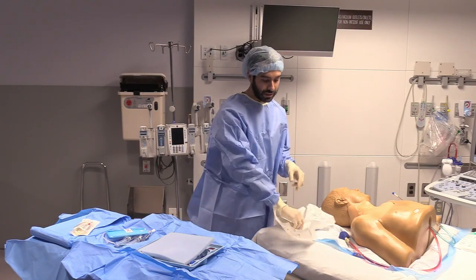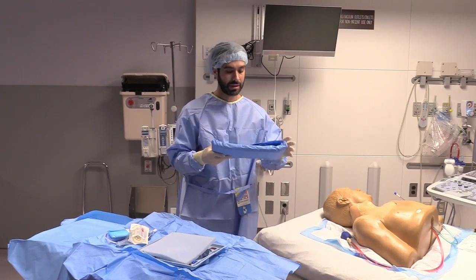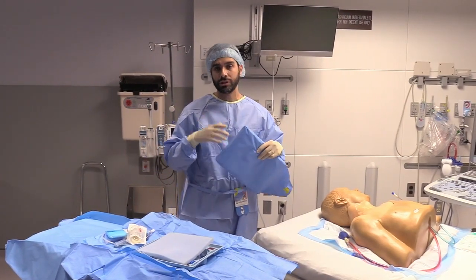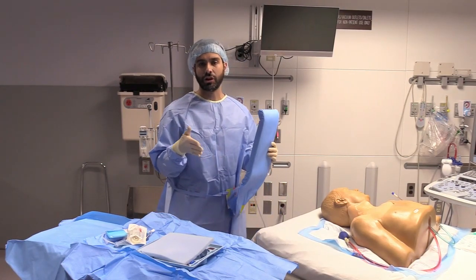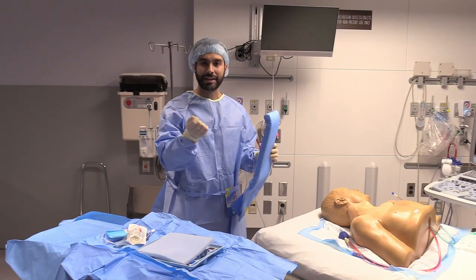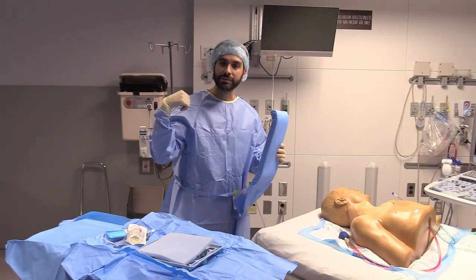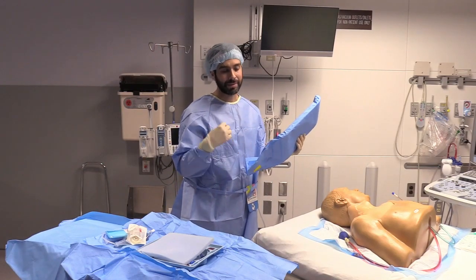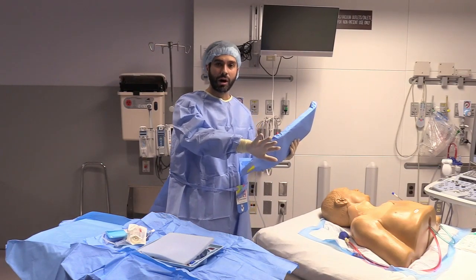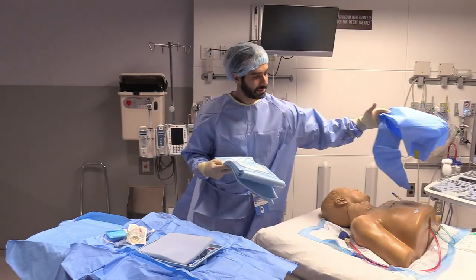So once you've got your gloves on, then you're going to go ahead and place the drape on the patient. You've already cleaned the patient once with a ChloraPrep. You'll clean again. One thing that I do is the nasal cannula oxygen often gets in the way, so I like to take it off that ear and tape it on the other side. If the patient has a gown, I open up all the buttons in the right arm so that the gown doesn't come up underneath the sterile area. If the patient has EKG leads, I try to move those off, so again, those aren't coming up where we're going to be placing the catheter.